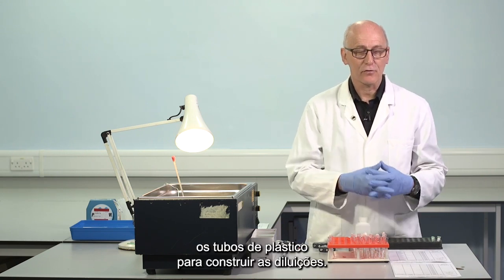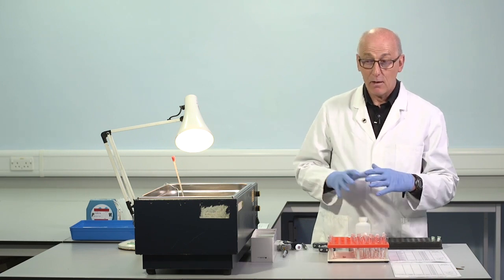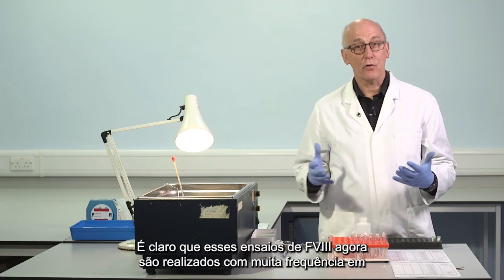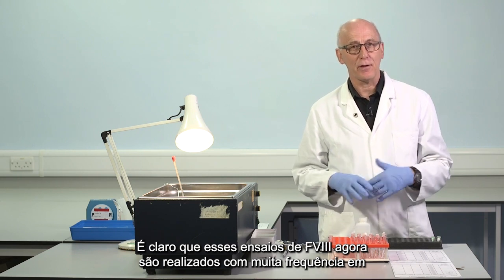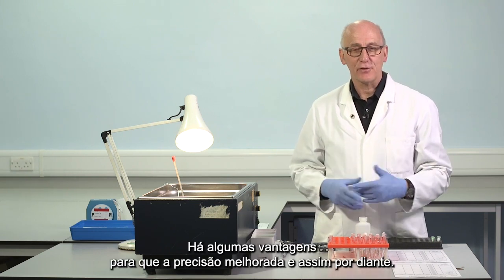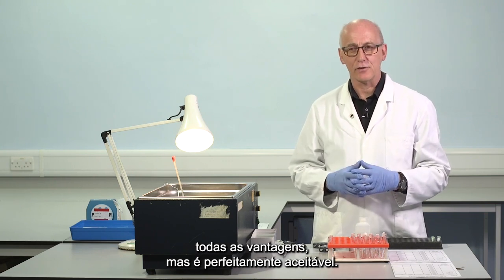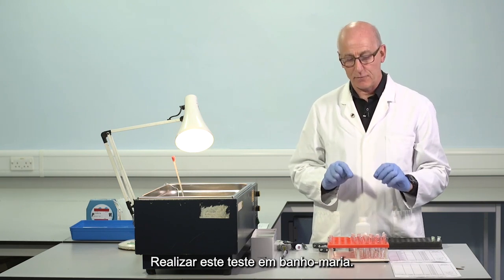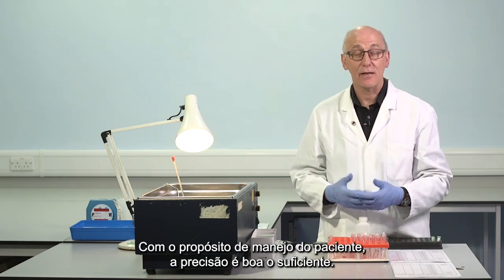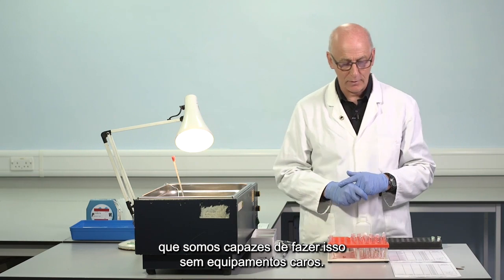The plastic tubes to construct the dilutions, these should be the same that would be used for a factor VIII assay. We're working in the water bath just now because we want to illustrate the principles. Of course, these factor VIII assays just now would be very frequently performed on auto-analyzers, and that's perfectly acceptable. There's some advantages to that, improved precision and so on, faster processing, all advantages. But it's perfectly acceptable to perform this test in a water bath for patient management purposes. The precision is good enough, and I think we're lucky in hemostasis testing that that's true, that we're able to do this without expensive equipment.